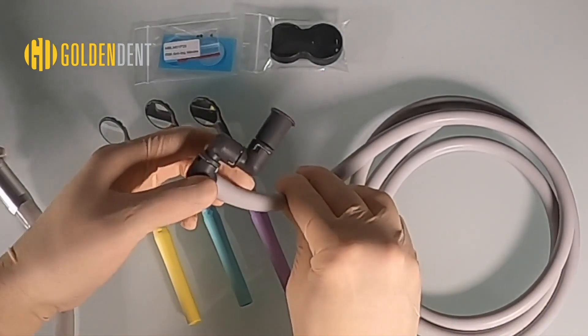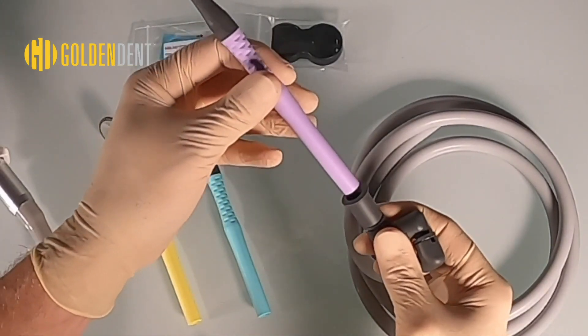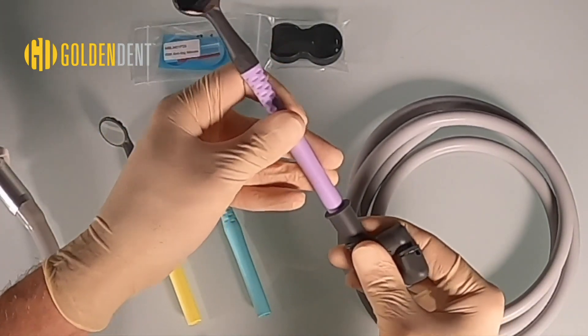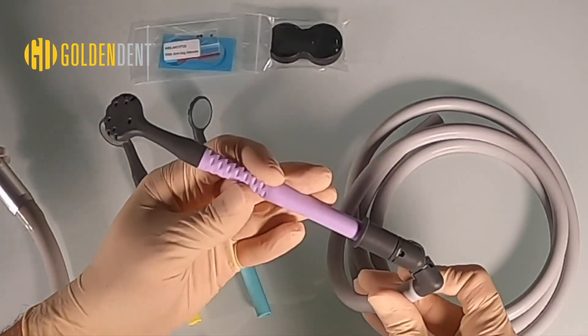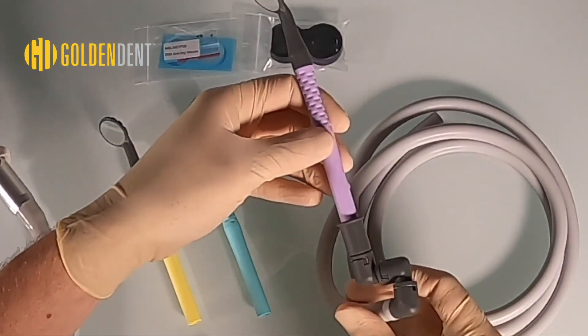The 360 multi-angle pivot connection tubing connects directly to the base of the mirror handle. The 360 pivot reduces drag on the cord and increases movement and accessibility while working.